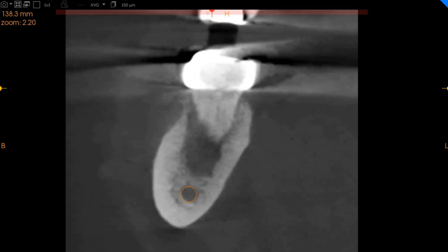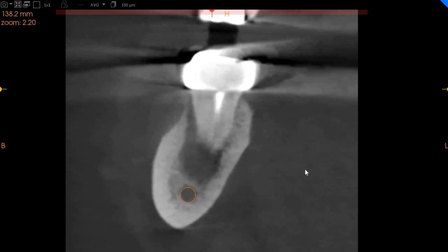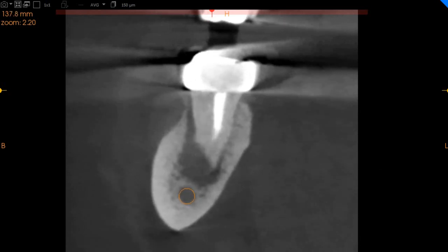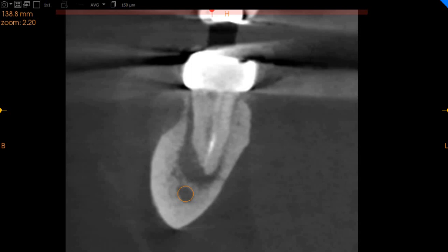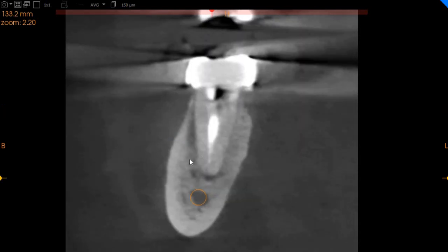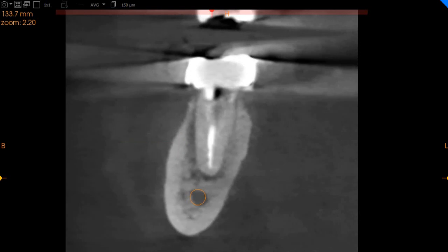When we move to the lower left 7, the mesial root of the lower left 7 has a missed canal, which can be seen here. This is the distal aspect where we can see the radiolucency and the PDL widening.